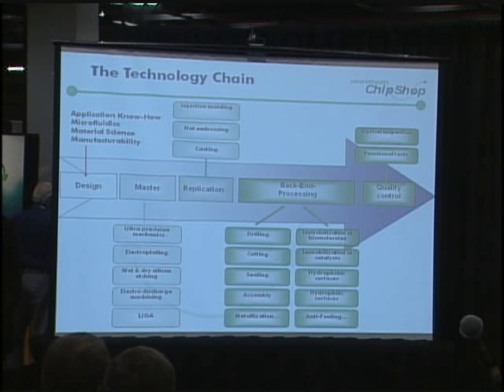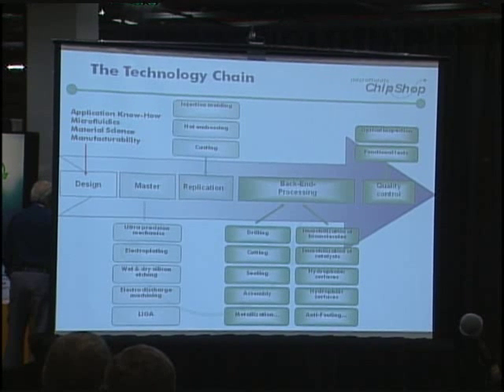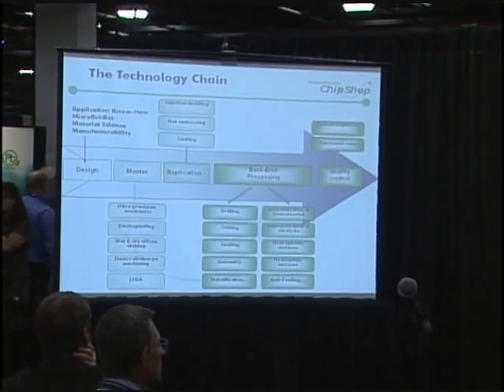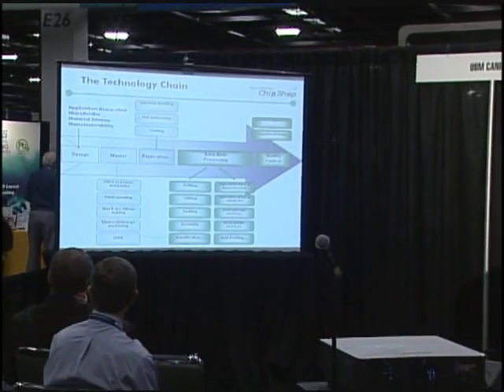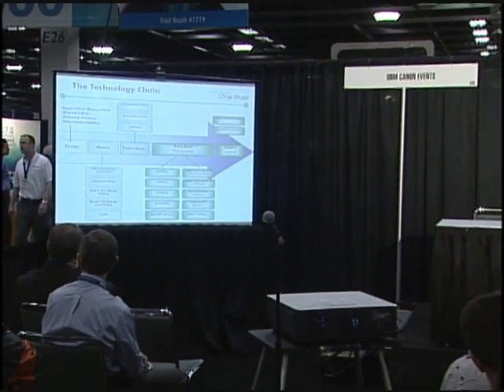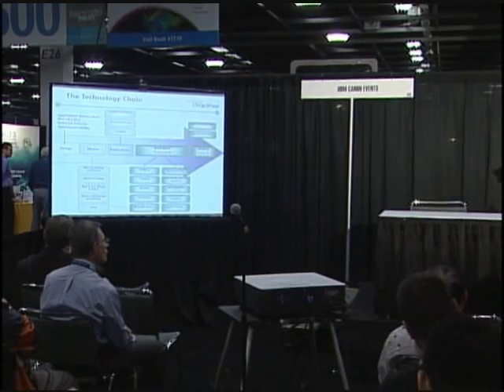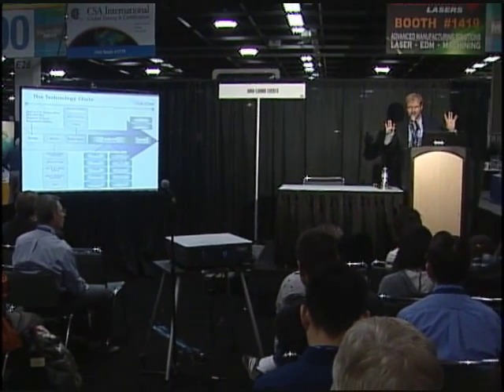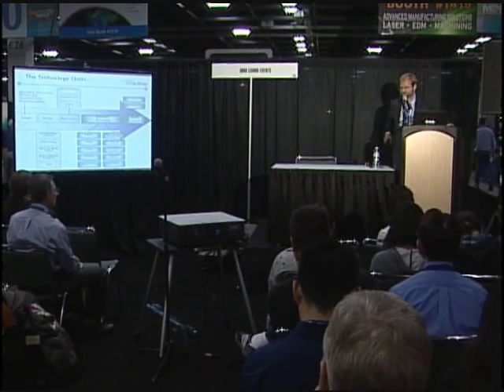In the next step, then, you replicate that master, and I would say for our commercial devices, 95% of what we're doing is injection molded. We do hot embossing as well, and we do also casting, but I always tell people, particularly from academia who have been working with silicone casting, PDMS is bad. It's really bad. You don't want to use that in a commercial product.